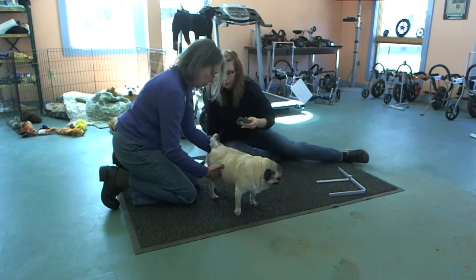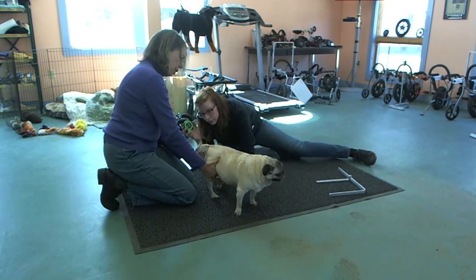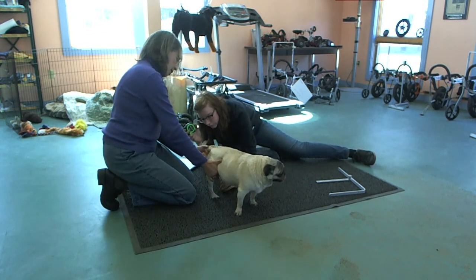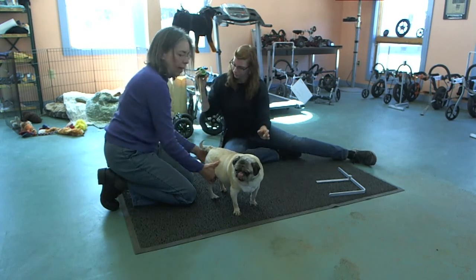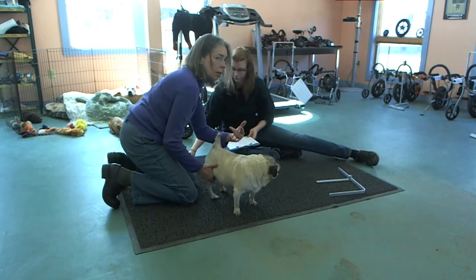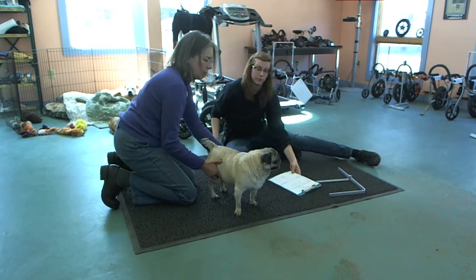And then for D, we're going to come in behind her, put our hands between her legs, and measure to her pelvic floor. Seven. So that's the normal proportion: A was twelve and a half, D was seven — it's usually about two-thirds of the head.